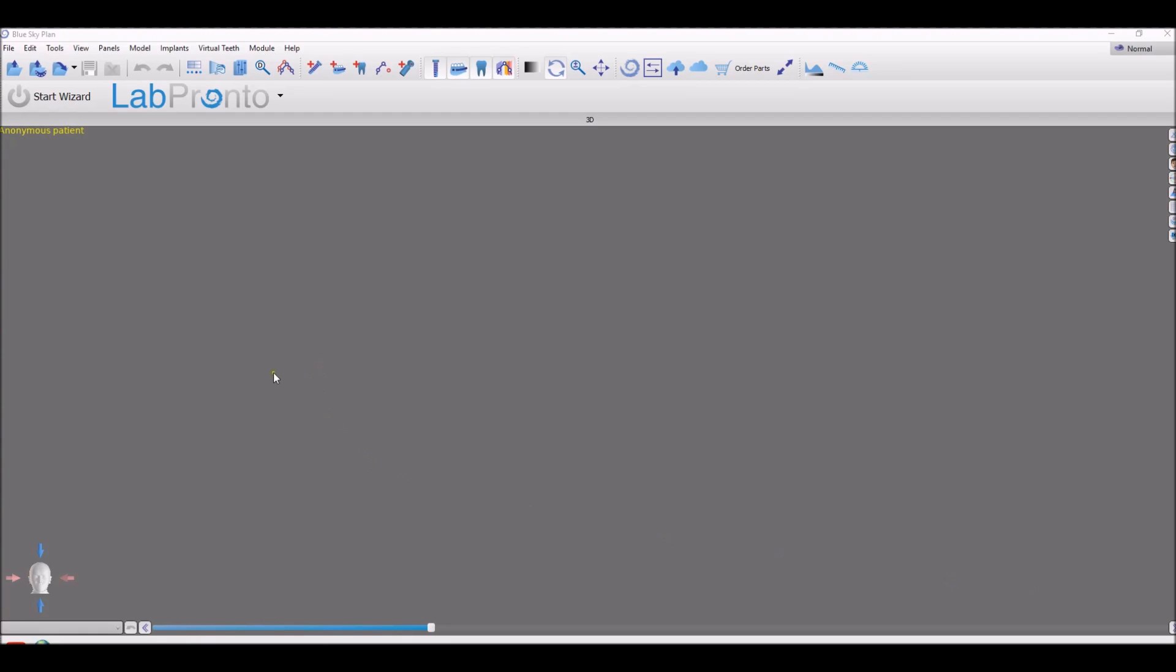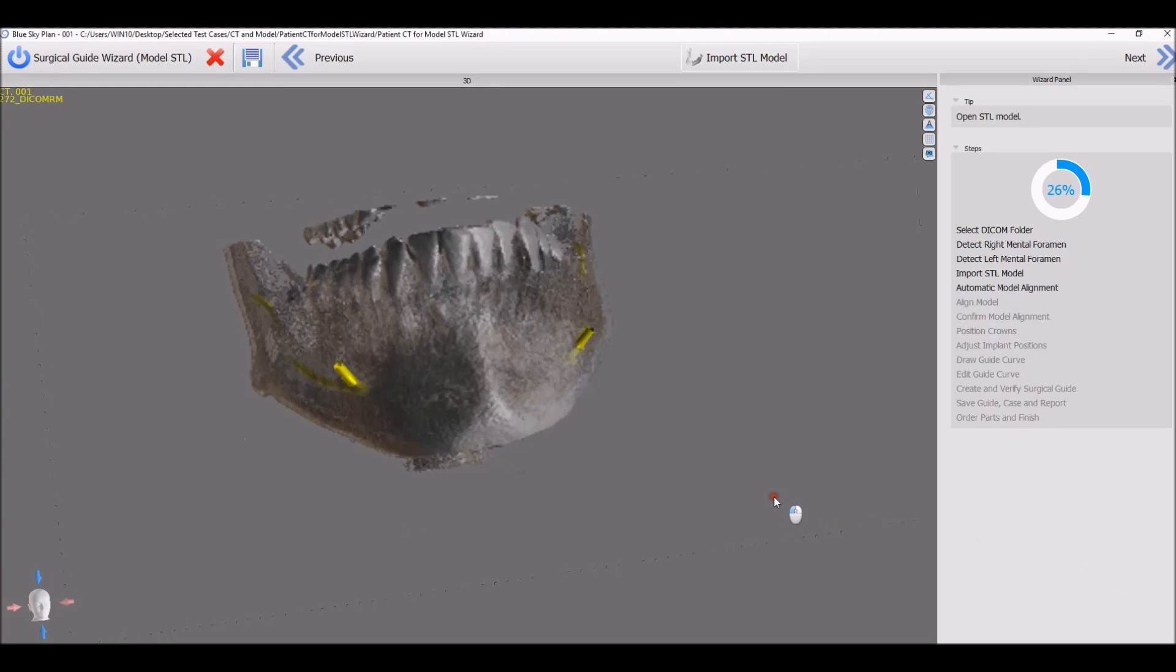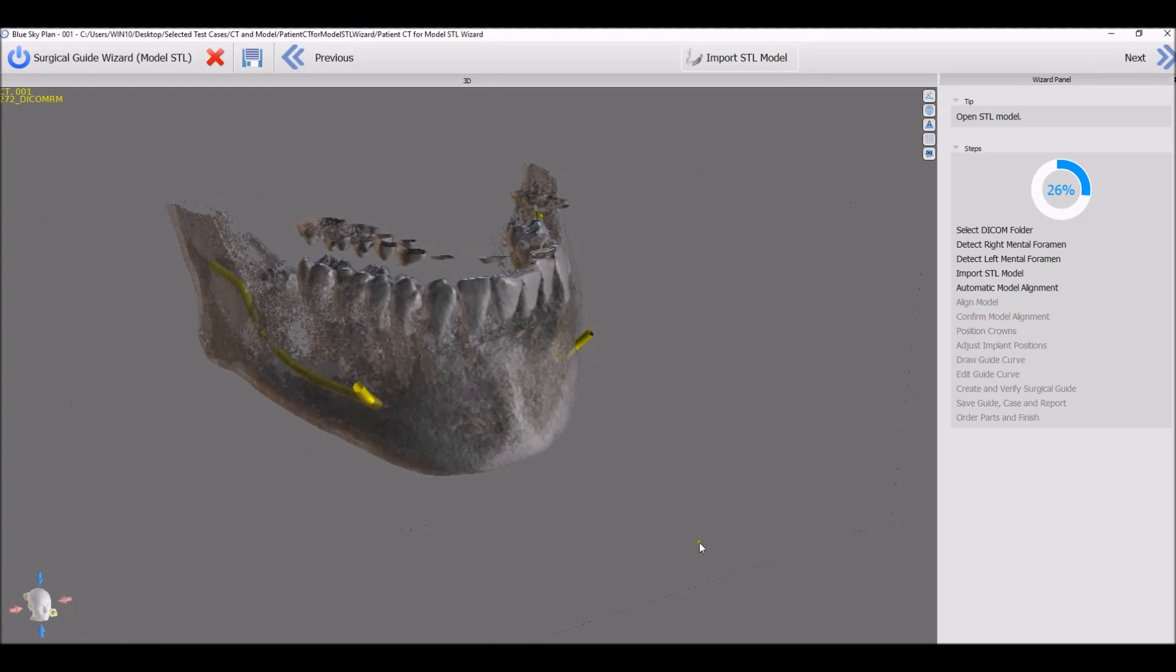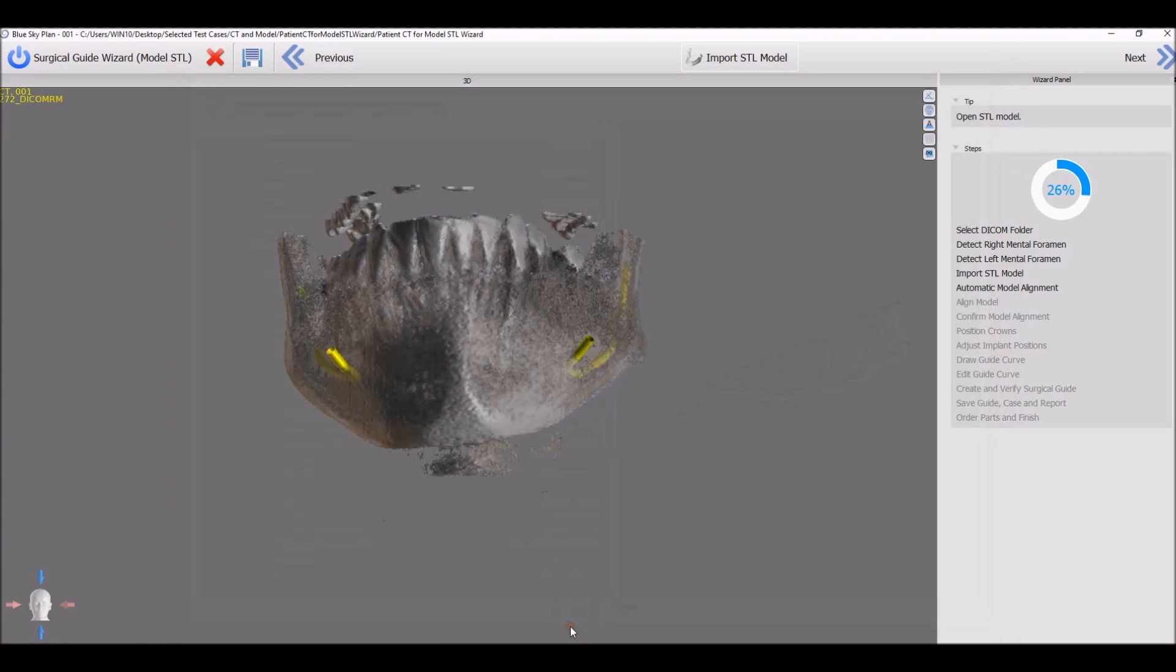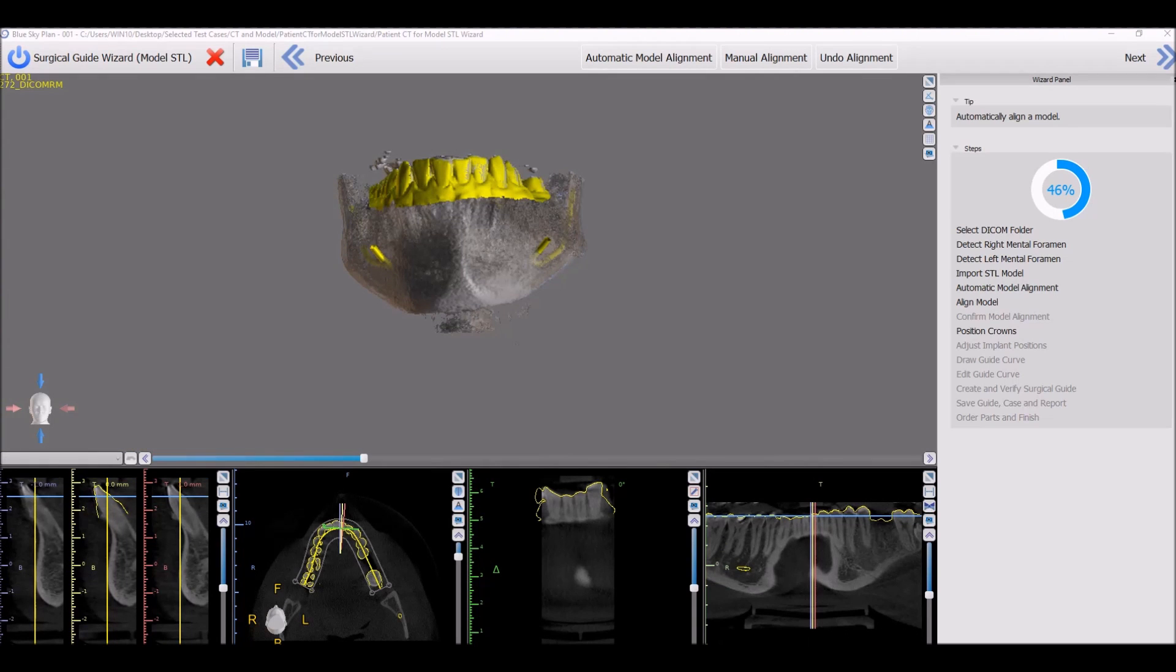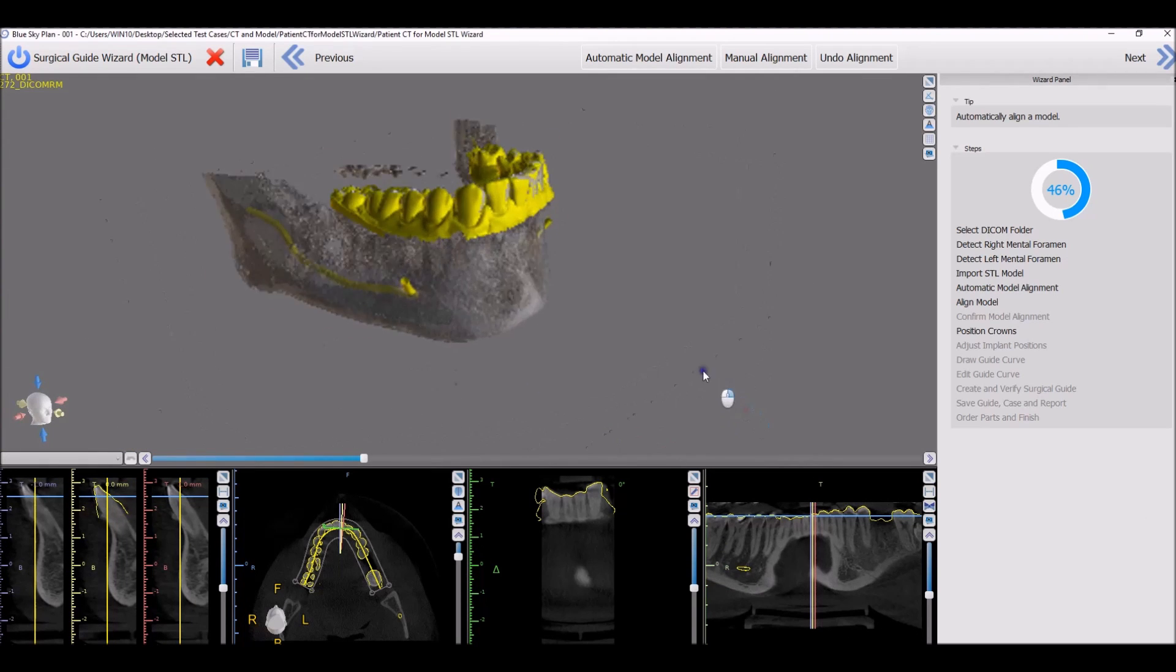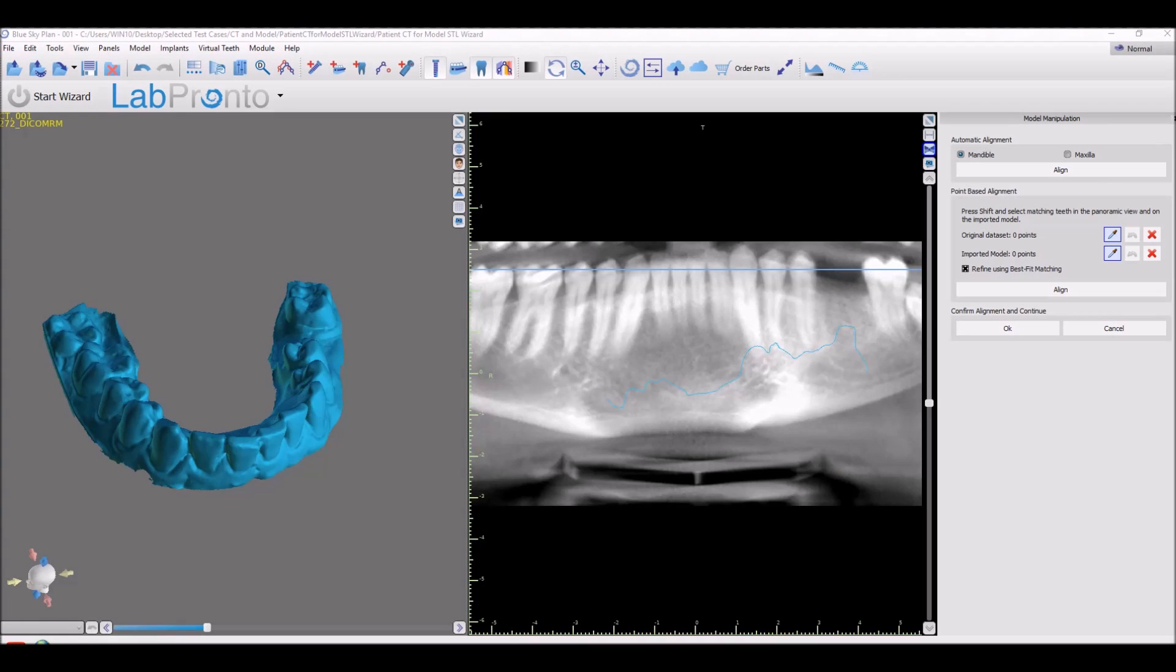Take a look at our updated wizard with a new automatic STL to CT merge. That's a completely automatic merge. You don't need to click on any teeth any times, don't need to mark any spots. Select the STL model, select the relevant jaw type, and the software does a fully automatic merge of the STL model to the CT of the patient. And that's integrated into our normal mode and advanced mode as well just by clicking the jaw type and clicking align.